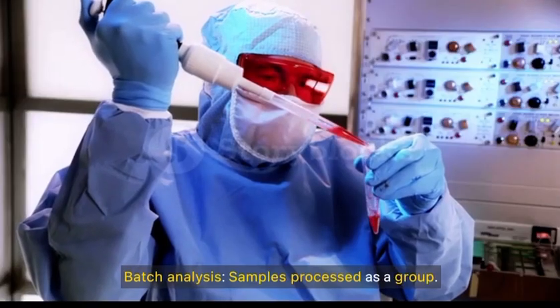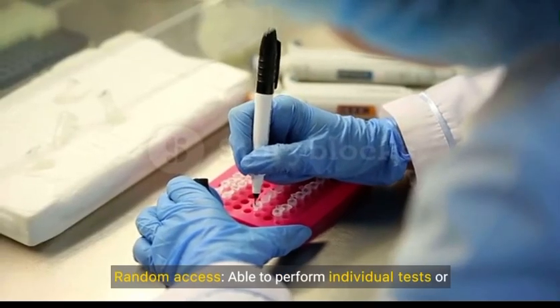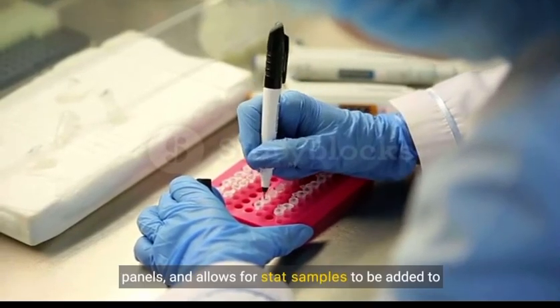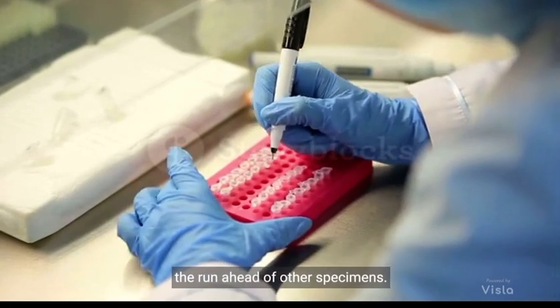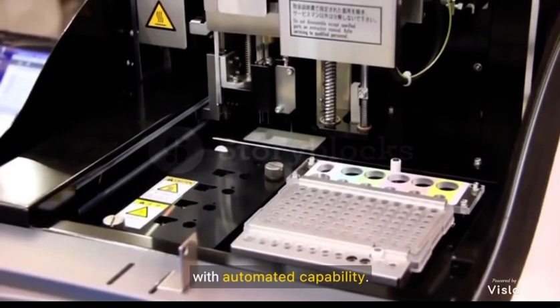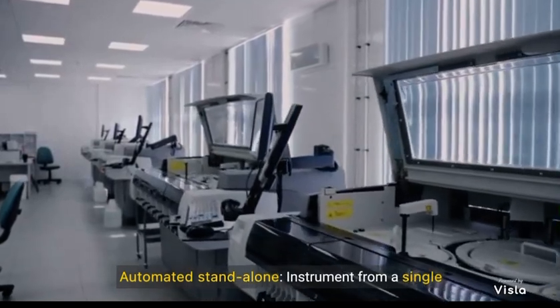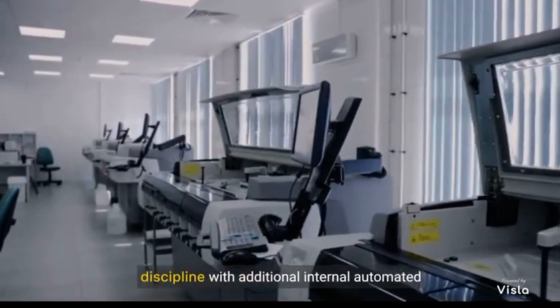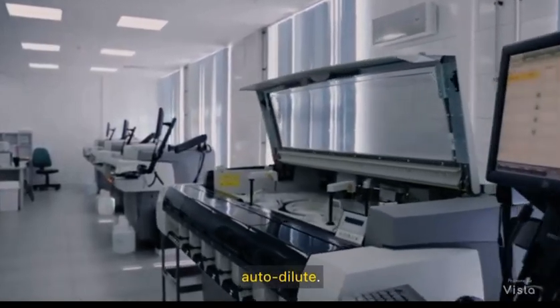Batch analysis. Samples processed as a group. Random access, able to perform individual tests or panels, and allows for stat samples to be added to the run ahead of other specimens. Standalone, instrument from a single discipline with automated capability. Automated standalone, instrument from a single discipline with additional internal automated capability, for example, auto-repeat and auto-dilute.